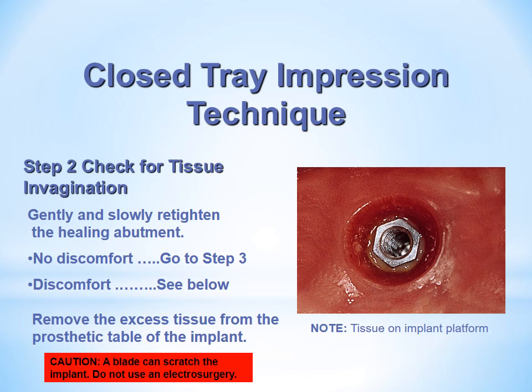See the tissue around the fixture. If there is any abnormal growth of the tissue or discomfort, treat it before taking the impression.